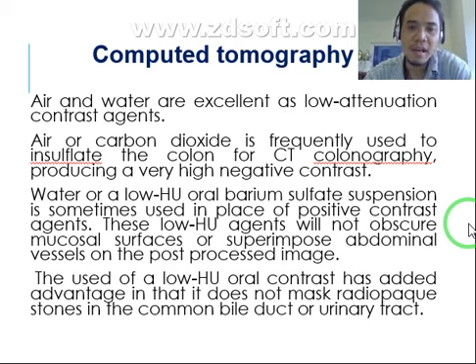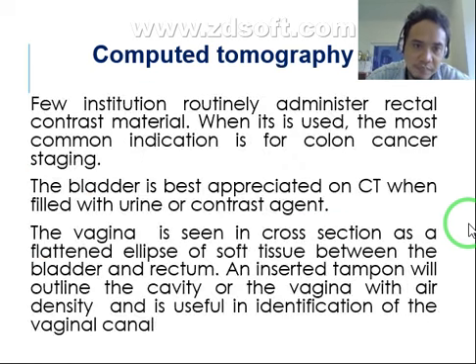So dili siya mag-superimpose dito sa katong mga stone sa gallbladder or sa urinary tract because low attenuation HU man siya. Kaya always remember na ang stones is radiopaque. Okay? Very radiopaque siya. Kanang hayag kay siya or puti kay ang appearance. So kung nagamit ang positive contrast media, na tendency nga mag-superimpose ang kaning mga stone dito sa contrast media.